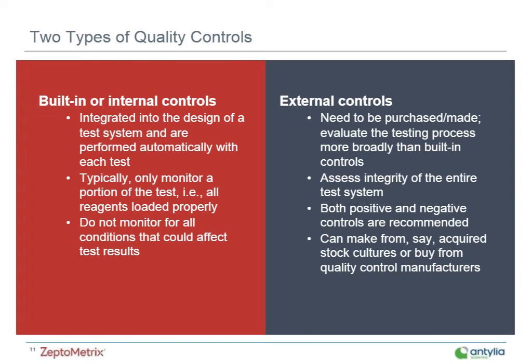So before I jump into the differences of controls, I want to talk about quality management systems a little bit. Your lab's quality management system provides a framework for you to manage and monitor the activities going on in your lab to address both quality standards and the goals of your organization. I think there are countless considerations that go into these quality management systems that we really won't touch on today, things like purchasing and documentation, personnel. You can go on and on about that.